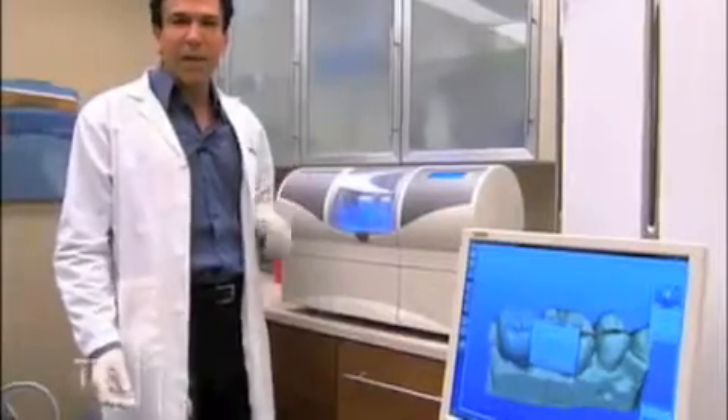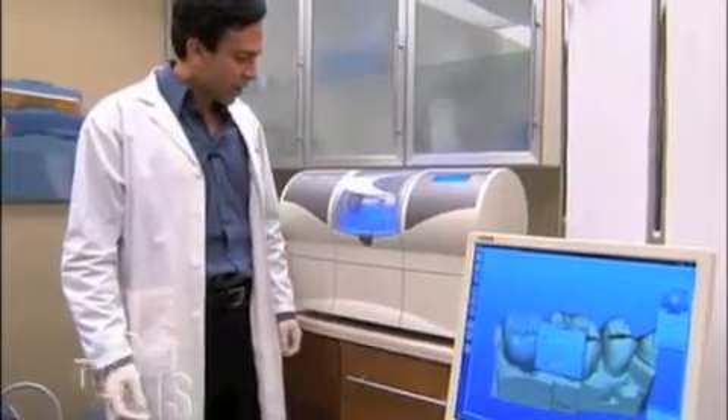Basically, what the CEREC machine is now doing is reading the impression that we took. It's also integrating the patient's bite, because it knows where his lower teeth go. So this crown will fit in every dimension. It's almost done — about three more seconds. All right, there we go.